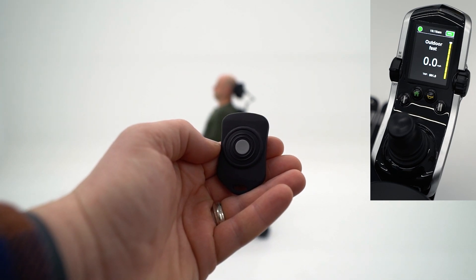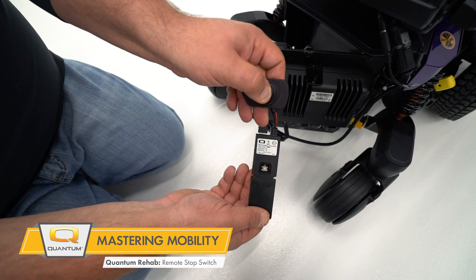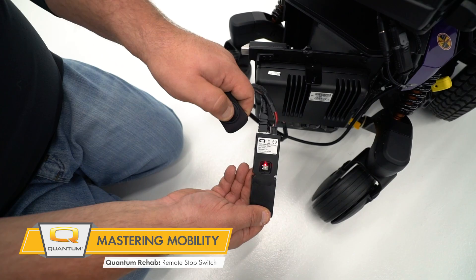The remote can be operated up to 20 feet behind the power chair, and additional fobs can be programmed to one receiver if desired. This is available on most Quantum power chairs and can be retrofitted in the field with any Q-Logic electronics.